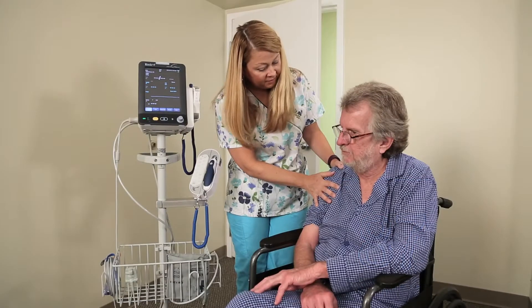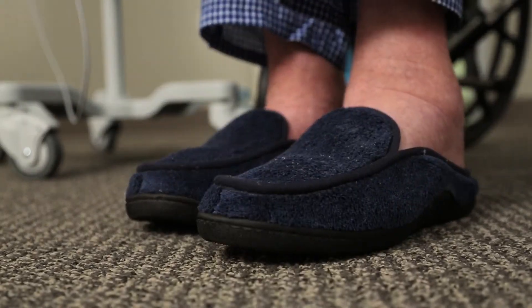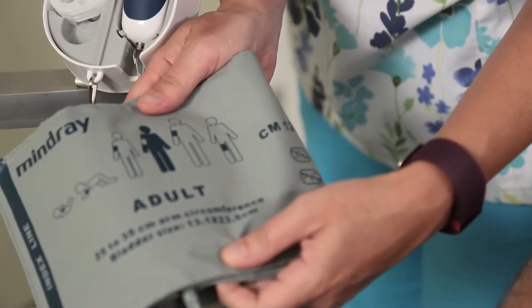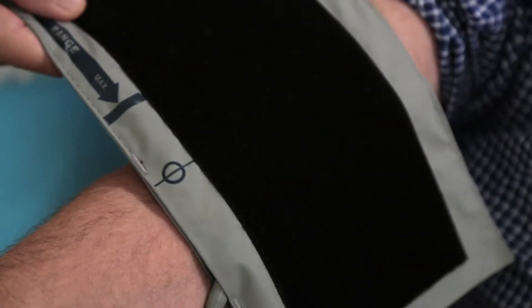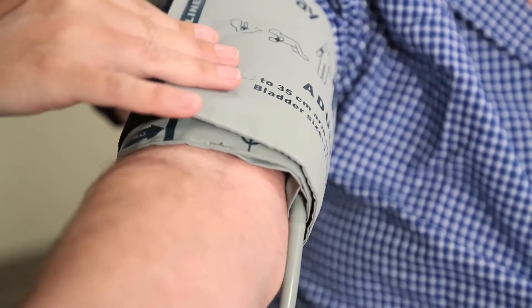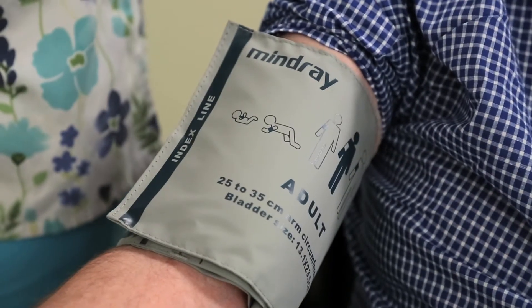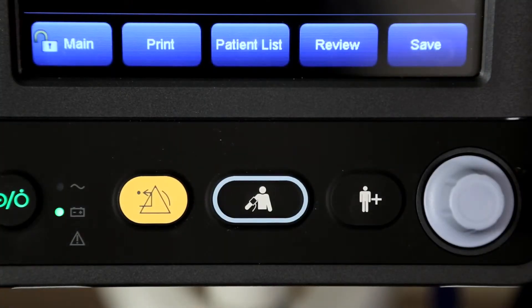For the best results, make sure the patient is comfortably seated, legs are uncrossed, feet flat on the floor, and the back and arms supported. Make sure you select the appropriate sized cuff by referring to the limb circumference marked on the cuff. Apply the cuff to the patient's upper arm or thigh and make sure the marking on the cuff is aligned with the artery. Do not wrap the cuff too tightly around the limb, as it may cause discoloration and ischemia of the extremities. Make sure that the edge of the cuff is within the marked range; if it is not, use a cuff that fits properly.